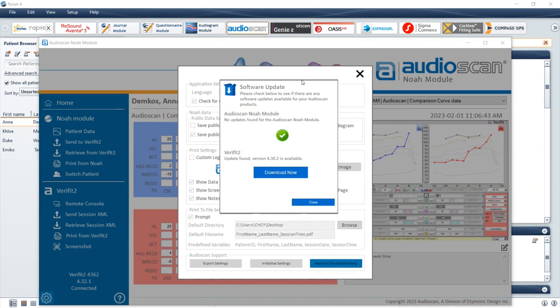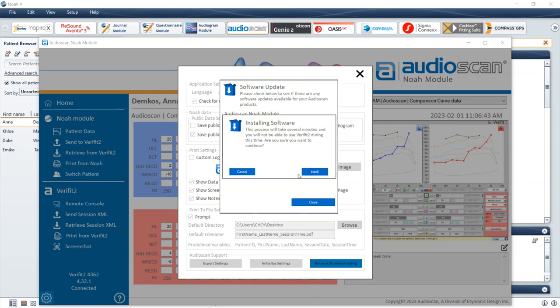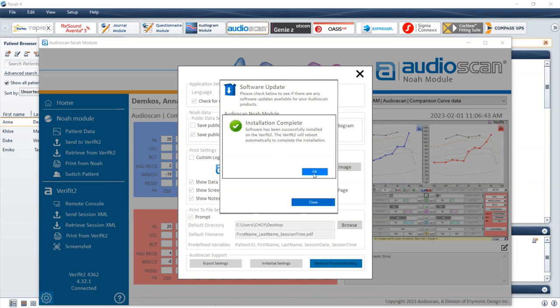If the latest version is installed, a check mark inside a green circle along with text will indicate that there are no available software updates for the AudioScan NOAA module. Follow the same process of downloading the software for the VeriFit2 or Axiom via the Download Now button, and then initiating the software installation on the equipment via the Install buttons. Be sure not to turn off the equipment during the process. If this occurs, we recommend installing the software via the AudioScan USB stick.